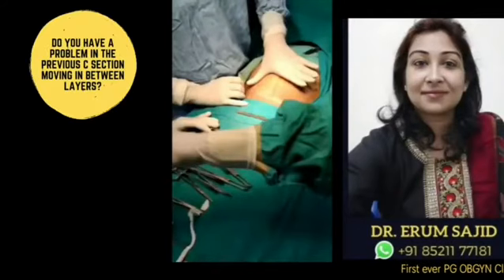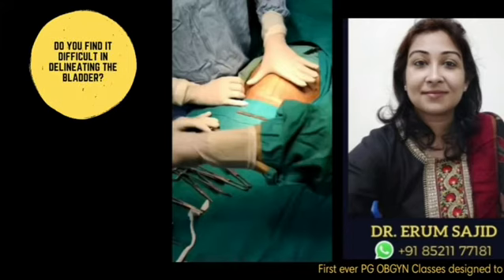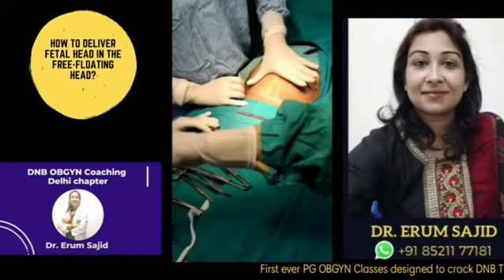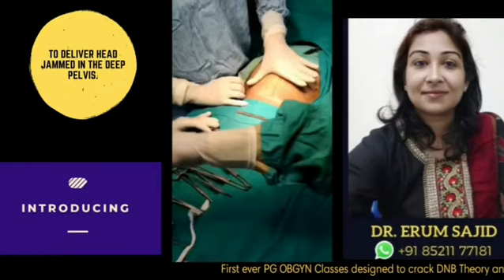Hello students, and welcome to this next case discussion and video on a C-section which I'm doing on a second gravida. Previous C-section was done outside 4 years back for fetal distress. This time she was under my antenatal care, and she came to me with decreased fetal movements, and I decided to take her up for C-section at 37 plus 4 weeks.